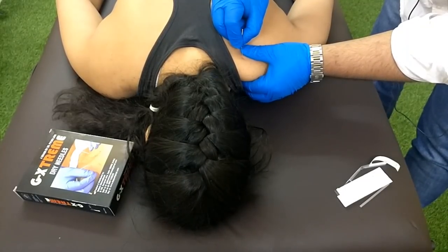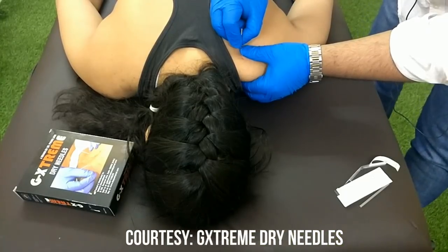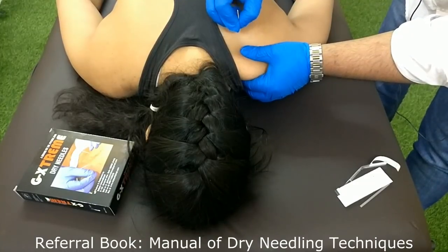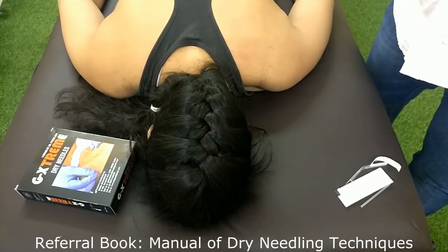The aim is not to get too many twitches. The aim is to injure the muscle as little as possible. After 30 to 40 pokes, we will be removing the needle and then prescribing post-treatment advice to the patient.